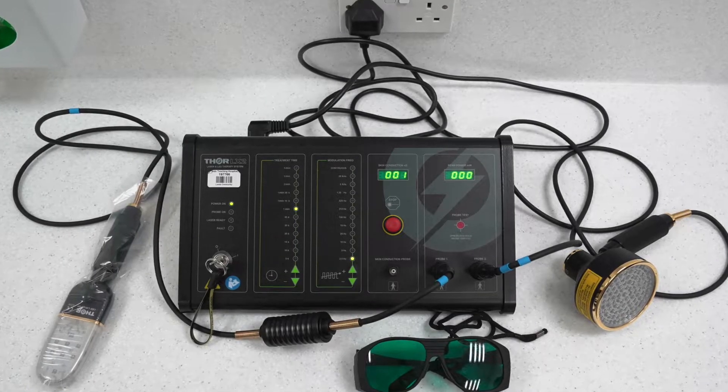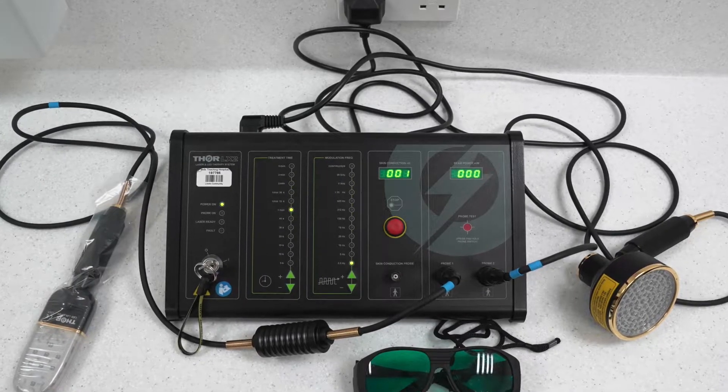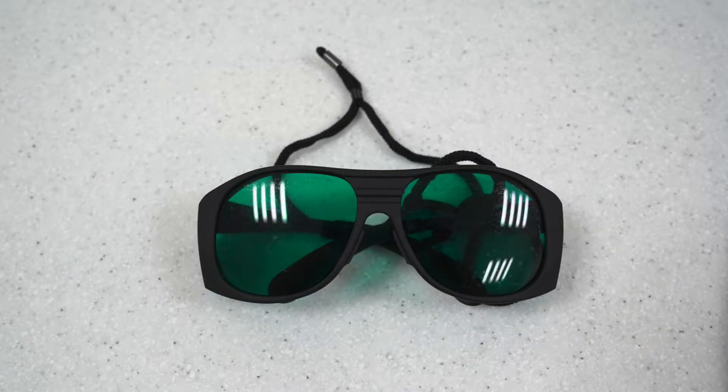This equipment delivers visible light from LED probes rather than being a low-level laser. The equipment is portable and the therapy can be delivered bedside or in the treatment room. Patients should be offered sunglasses for comfort, but the equipment does not present a danger to patient or operator's eyes.